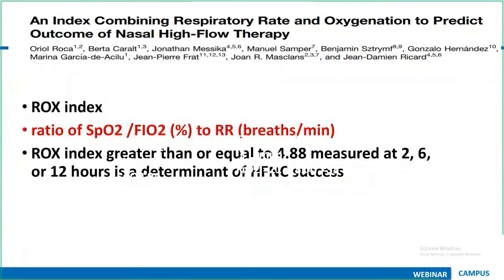So, dear friends, please understand that for the patient on NIV or HFNC, you should understand at what point you have to stop these and ventilate that patient. If you are delaying ventilation in that group of patients, you may not be able to rescue them. Even among the patients who are dying in my unit, those referred from outside, the majority of the time this is the issue. When we get a phone call, they say the patient is stable on NIV, saturating at 92%. Yesterday also I had a phone call.